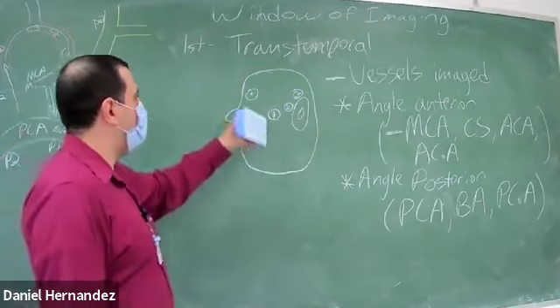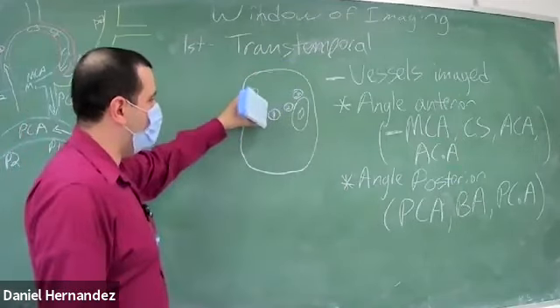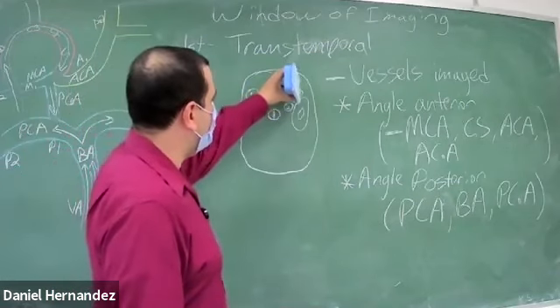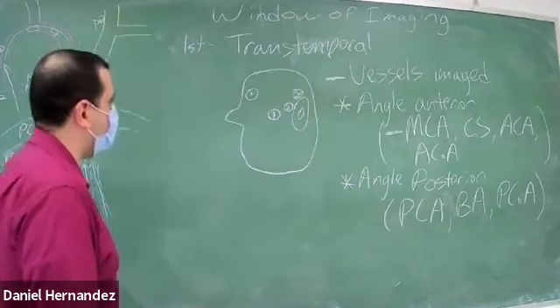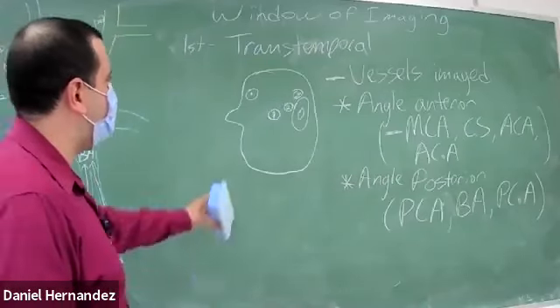And remember to utilize your three windows. Don't be fixated on one window. You may not necessarily see the vessel from that particular window. So try all three of your windows: your anterior approach, your periauricular, and more of a posterior approach.